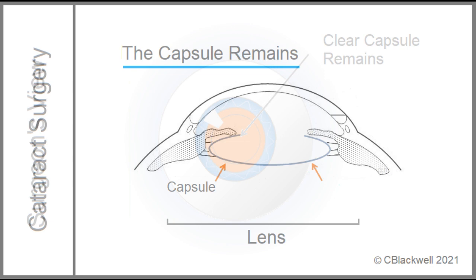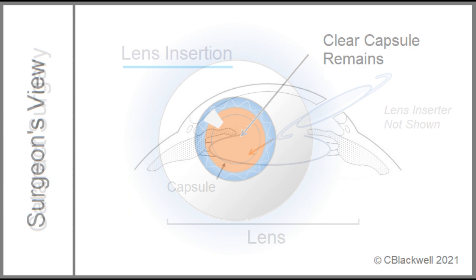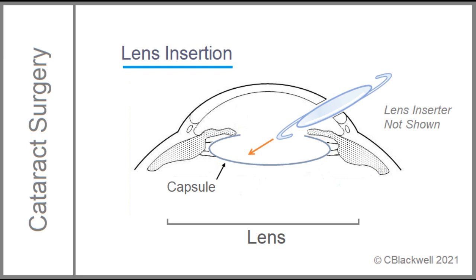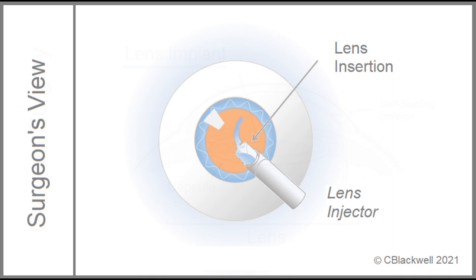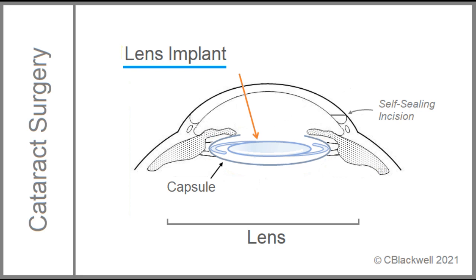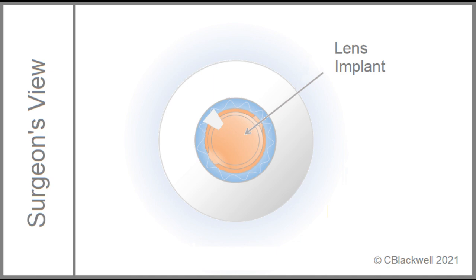With the cataract out, everything is clear with a nice orange reflex. Part three: through the same opening, the lens implant is inserted into the eye. This is the surgeon's view of the lens implant emerging from the injector. The lens is maneuvered into the capsular bag and centered. It may surprise you to know the incision is self-sealing — no stitches are needed. The inner flap is held closed by the pressure of fluid inside the eye.